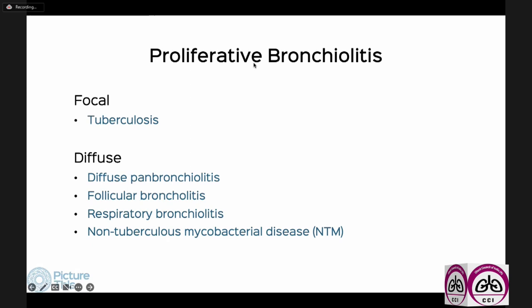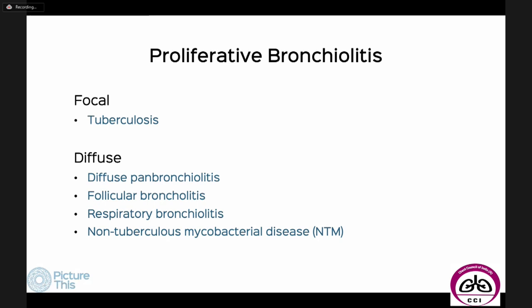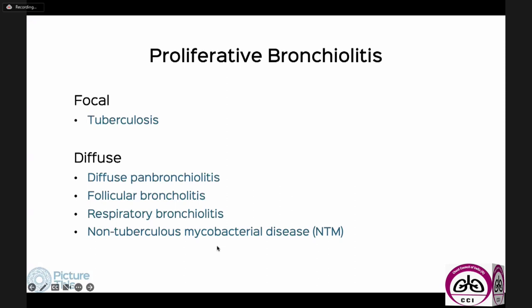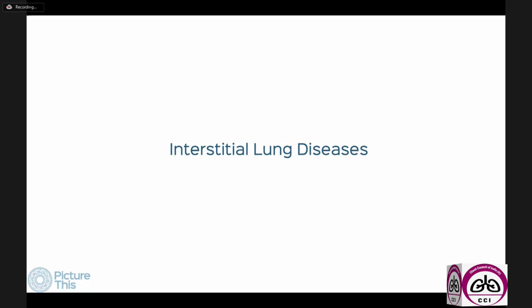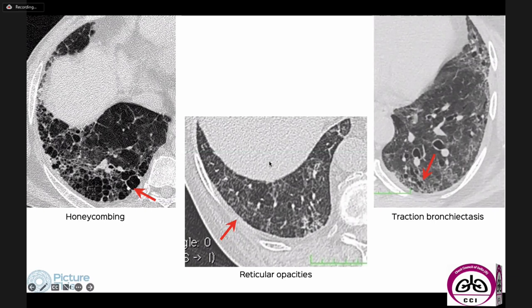To summarize: in focal proliferative bronchiolitis the commonest etiology is tuberculosis. When diffuse — widespread, softer, less dense, peripheral lesions — these are the conditions we would consider, but further etiologic diagnosis depends on the history and examination findings. We then move on to interstitial lung diseases, having covered bronchiectasis, emphysema, and small airways disease.